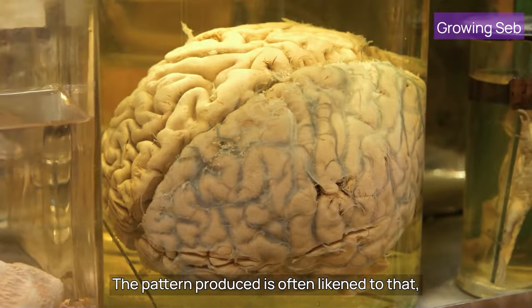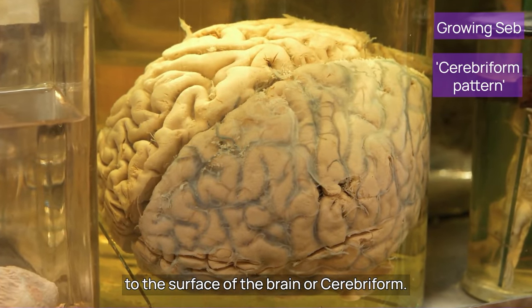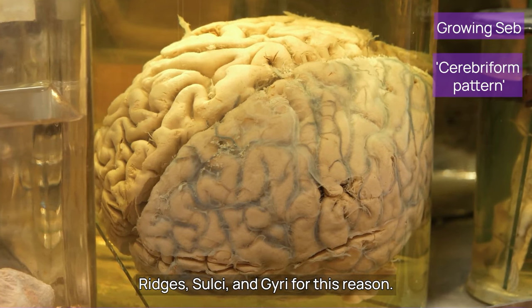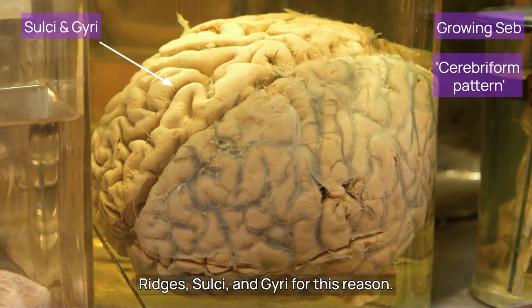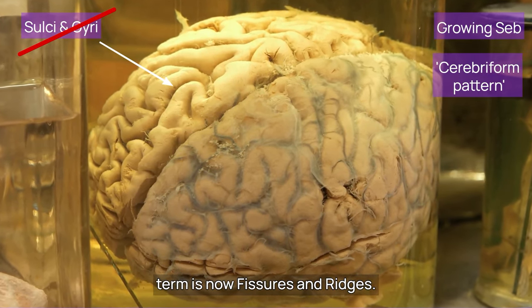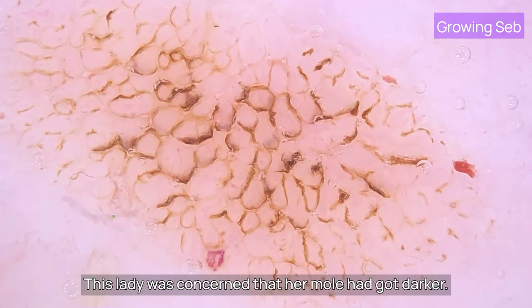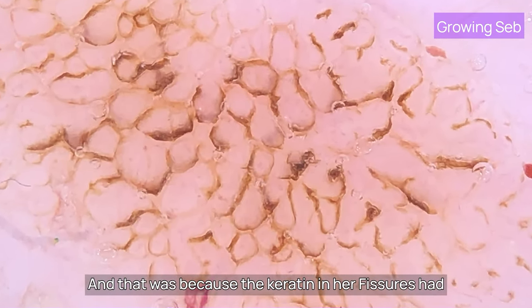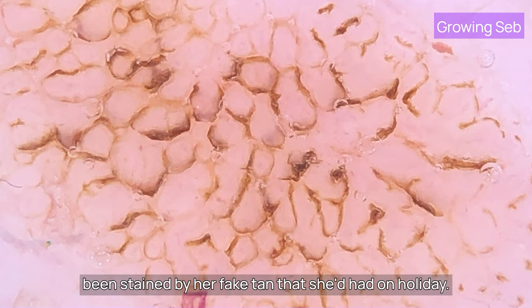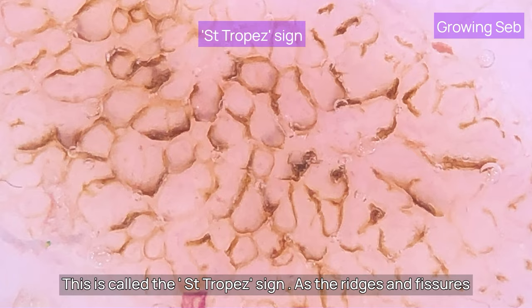The pattern produced is often likened to that of the surface of the brain — cerebriform. Some people call fissures and ridges sulci and gyri for this reason, but the internationally accepted term is now fissures and ridges. This lady was concerned that her mole had got darker — because the keratin in her fissures had been stained by fake tan she'd had on holiday. This is called the Saint-Tropez sign.